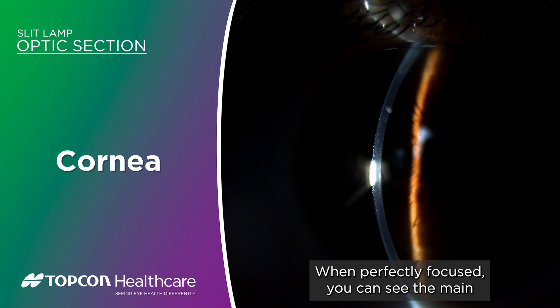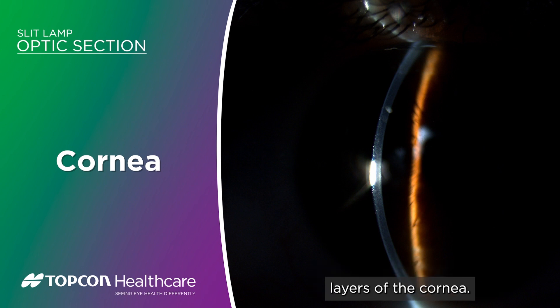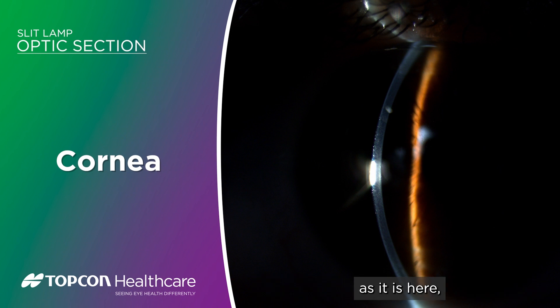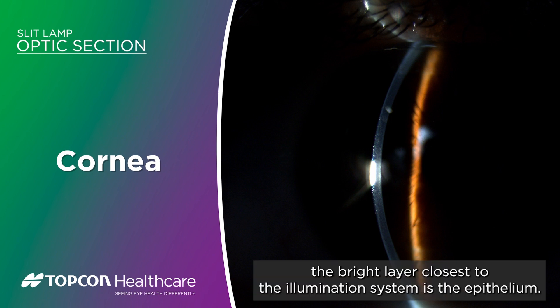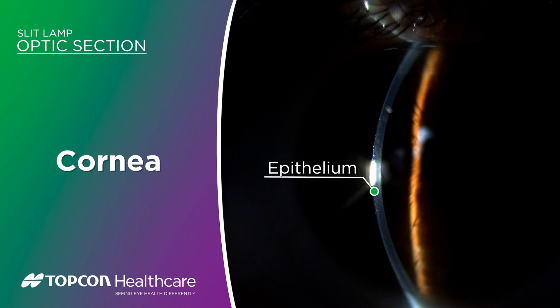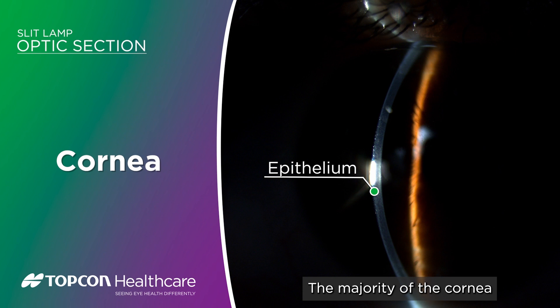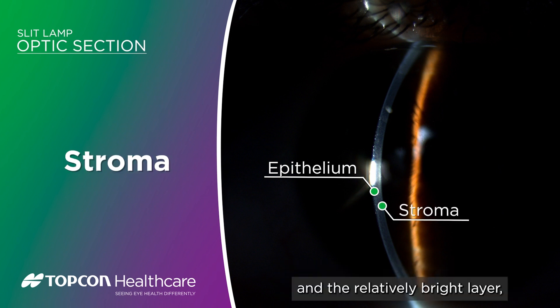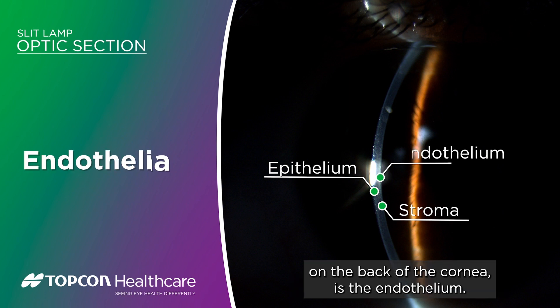When perfectly focused you can see the main layers of the cornea. With the illumination system on the left as it is here, the bright layer closest to the illumination system is the epithelium. The majority of the cornea is the stroma, which has the grainy appearance, and the relatively bright layer on the back of the cornea is the endothelium.